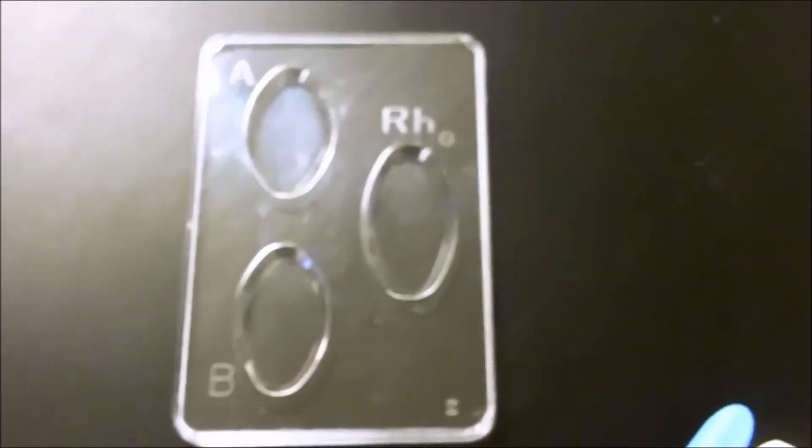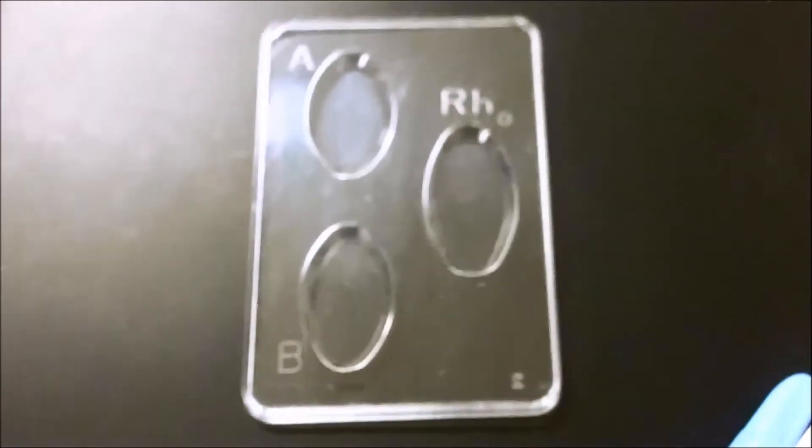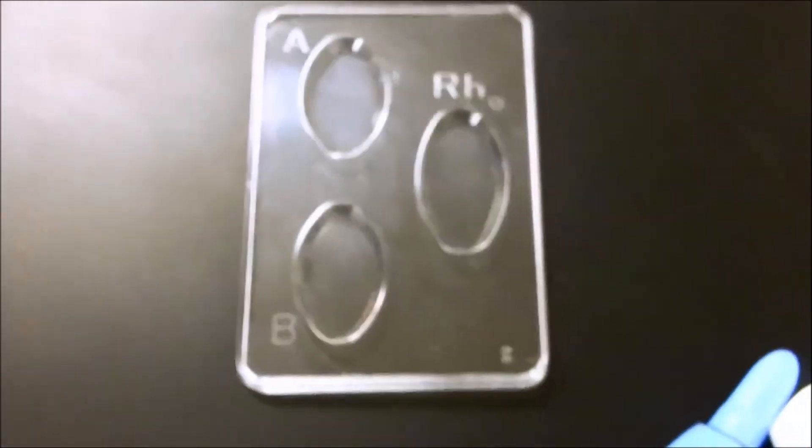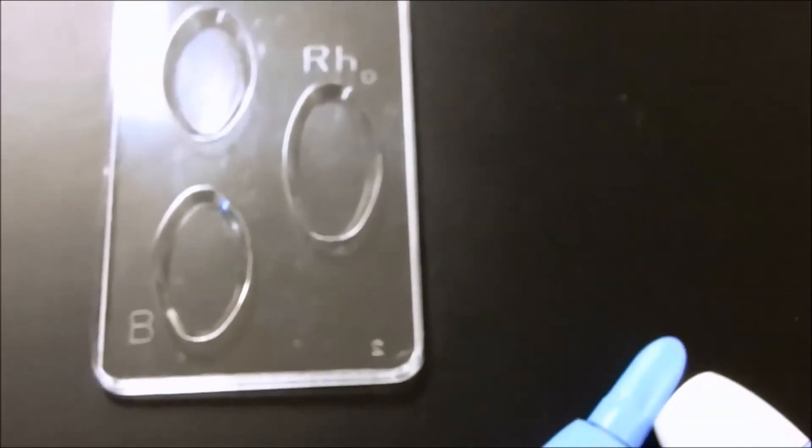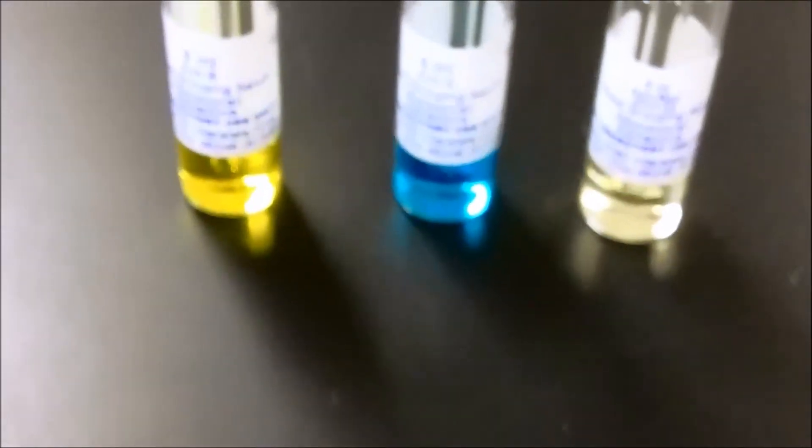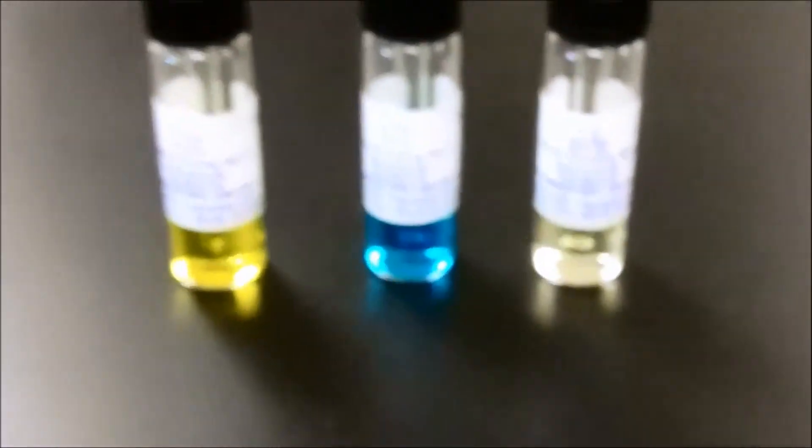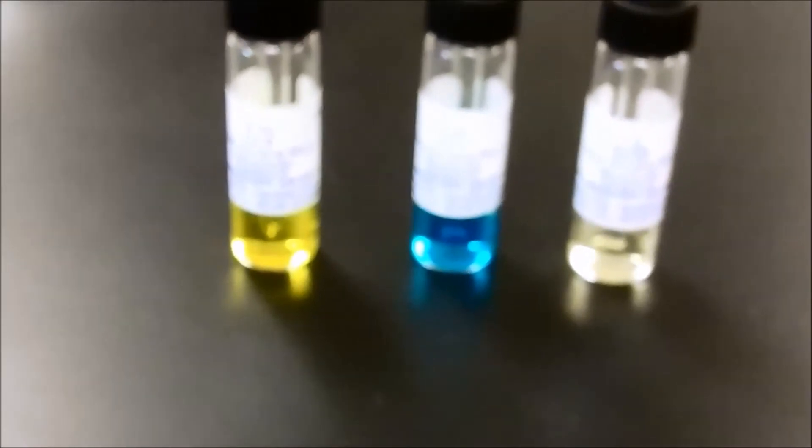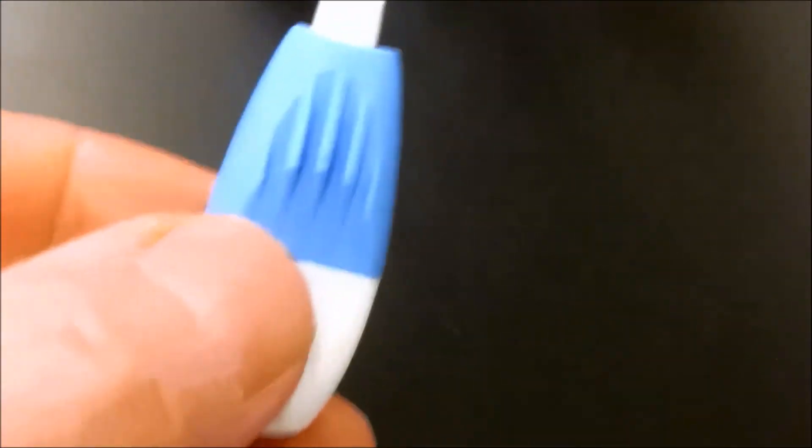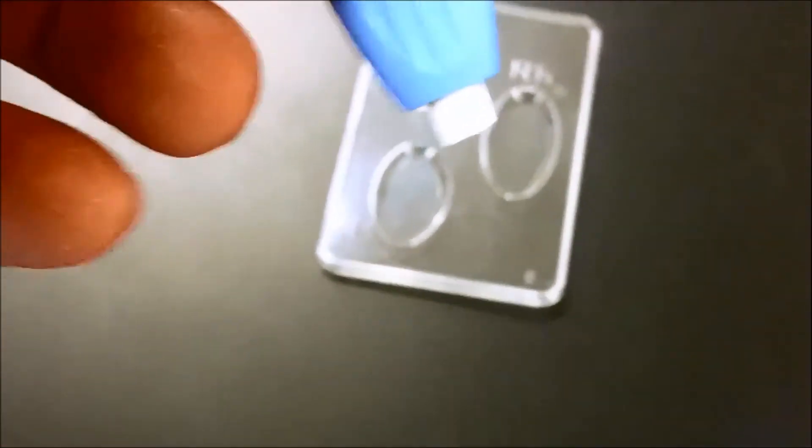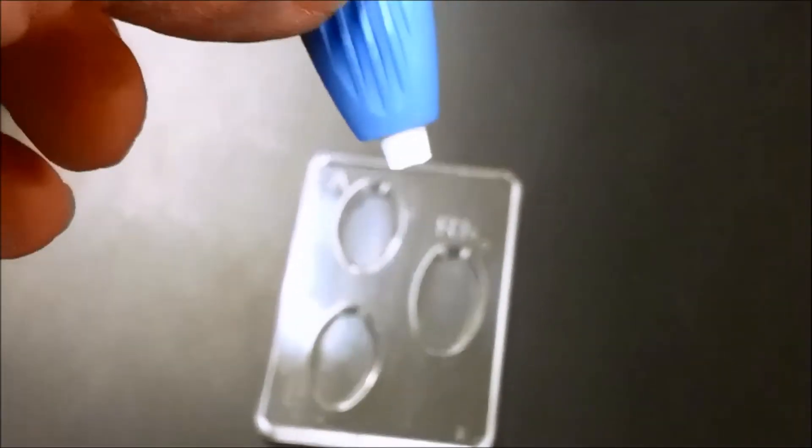I am O positive, so there should not be any clumping in AB, but there should be clumping in RH for me. Since these are held in the refrigerator and kept cold to preserve them, it may take a little bit of time, a minute or so, to get this done. So I'm going to use this finger sticker that you press against the finger, and then I'm going to shut this off while I get the blood because I'm all here alone. So I'm going to prick my finger, I'm going to get the blood into these tubes, and then we'll turn this back on.